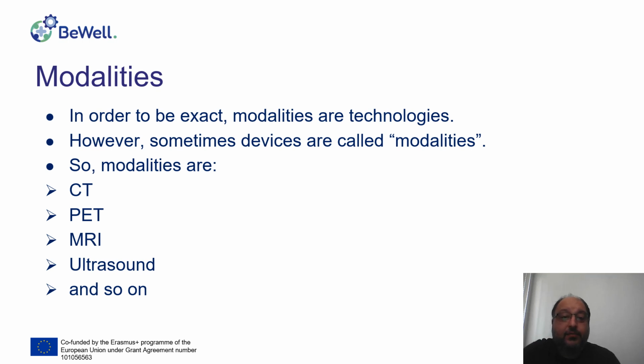The modalities, of course, are not supplied with the system, although manufacturers of the modalities usually provide, and may offer, a picture archiving and communication system. Sometimes some people consider devices as modalities, but this is not correct. The modalities actually are the technologies.